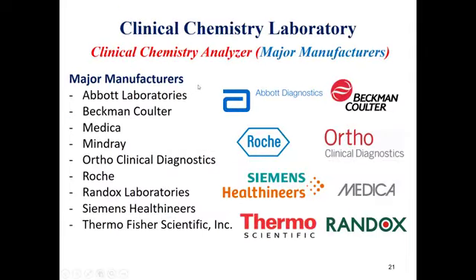We can see here the major manufacturers for clinical chemistry analyzers. The main difference between those manufacturers is the ability to manufacture different sizes. As we said, one of the classifications for clinical chemistry analyzers is the load size. For example, we have Beckman Coulter, Roche, and Siemens. They have all the load sizes for clinical chemistry analyzers, whereas other manufacturers have either one or two types of load size. For example, Medica has the clinical chemistry analyzer EZRA, which is used for small laboratories.